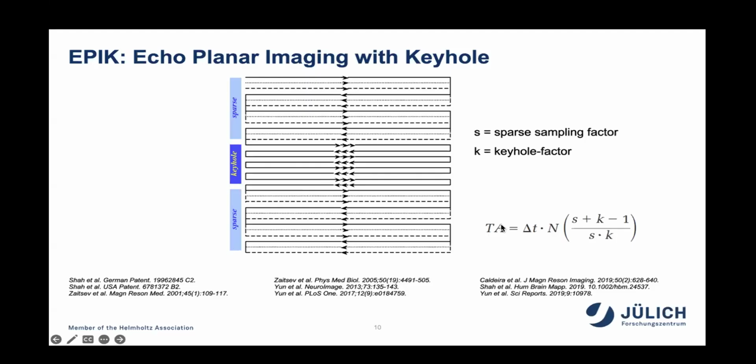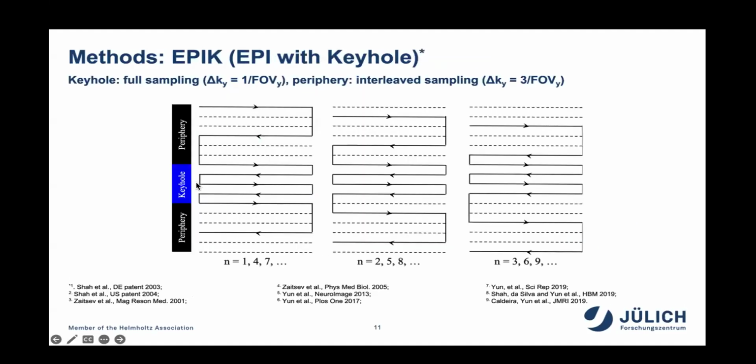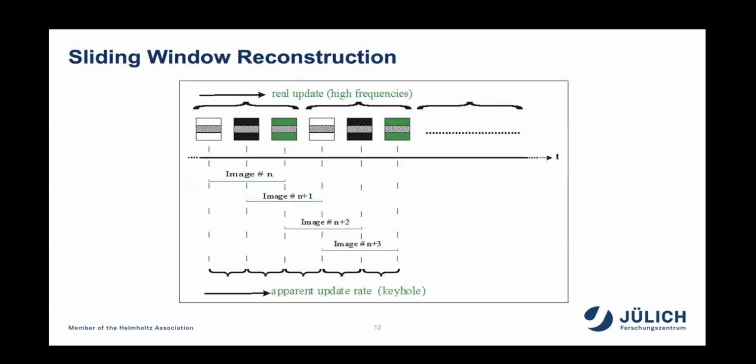And you'll say, yeah, but that's just an overlay of a high resolution with the low resolution. We have that controversy in MRI, not really controversy, it's a simple discussion. And that's just to show it to you again in 3 steps. You save the data and then reconstruct. And I'm pushing this point a little bit because I always get questions from referees who haven't really understood what we're trying to do.